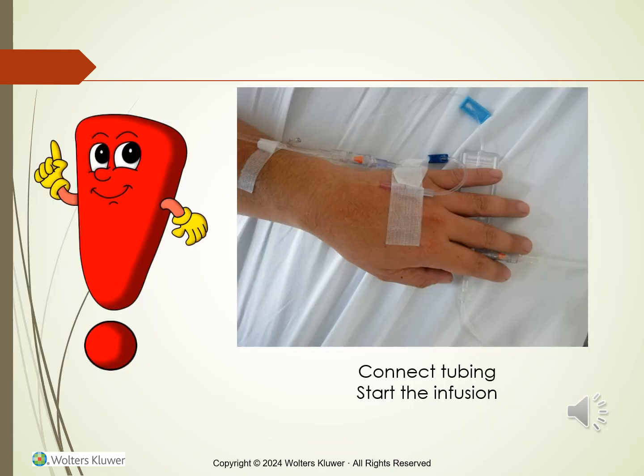Once the needle is inserted, you will see a blood return. This ensures that you are in the vein. If you do not see blood return, you will need to remove the needle, or call the IV team for help. If blood returns, you want to release the tourniquet and ask the patient to relax.